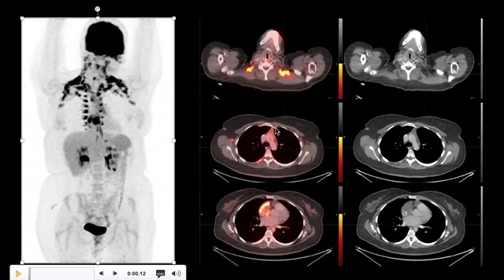There is soft tissue density in the anterior mediastinum with mild FDG uptake. This is physiologic uptake in the thymus, and also there is symmetric uptake in the breast tissue seen here.